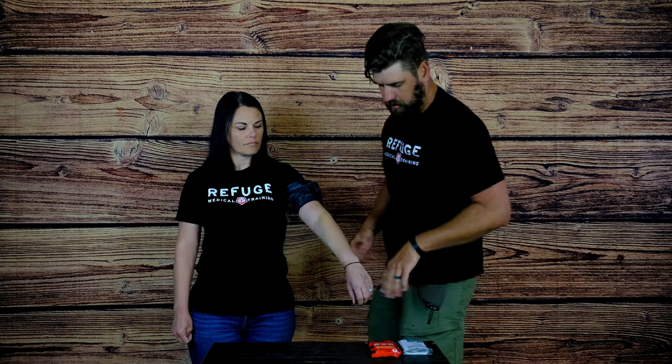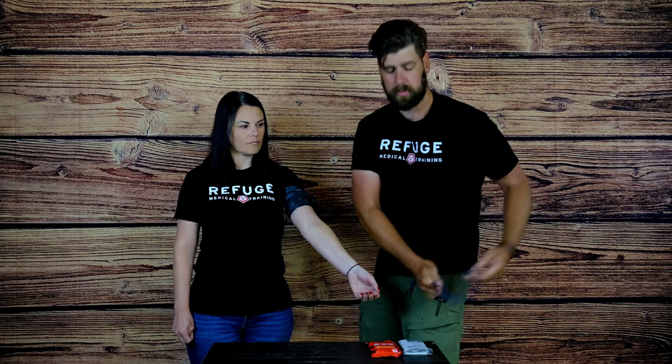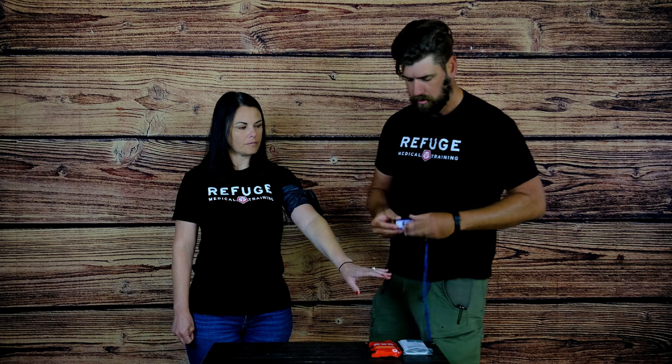Once you've done that you're going to check for a pulse — you do the traditional way. One thing I like to do is carry an EDC pulse ox, which you can pick up in our store. It makes it easier and less stressful to figure out if it worked or not.